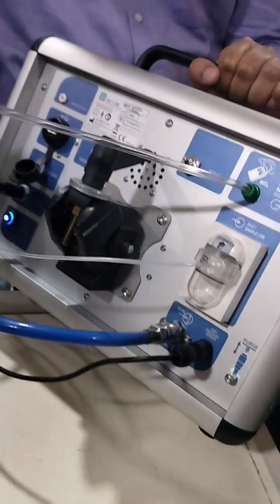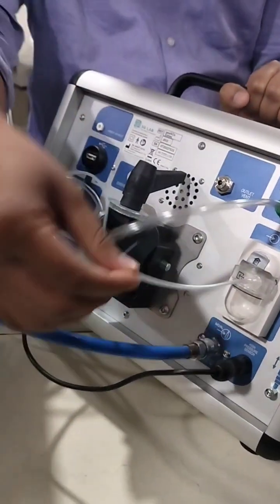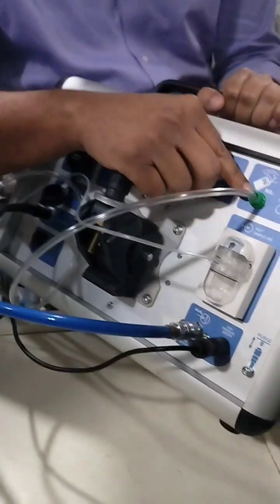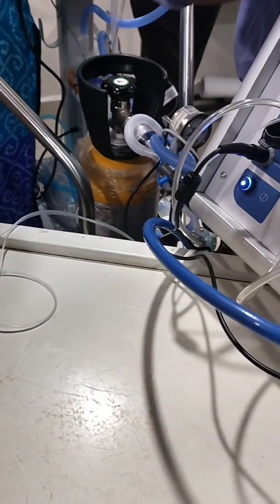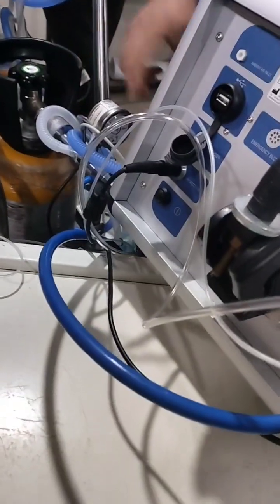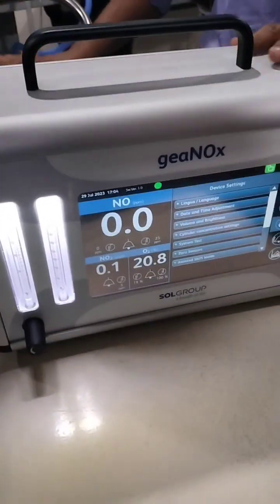This is the NO supply to the baby, and this is the trace line showing how much NO2 is being generated — the feedback loop. The two sizes are different with color coding in green, so there is no confusion. The connection from the cylinder to the dispenser is via this line, and there is a wire here that continuously measures how much gas and pressure is inside — completing the feedback loop.